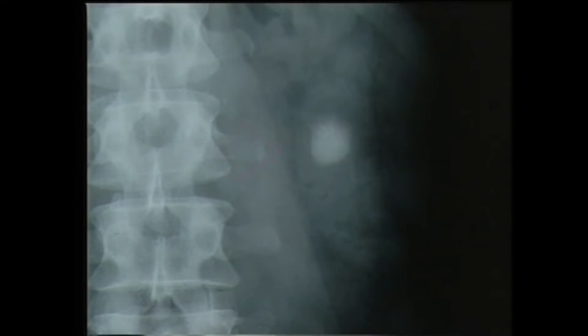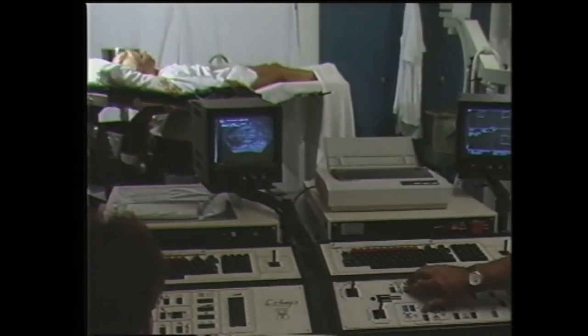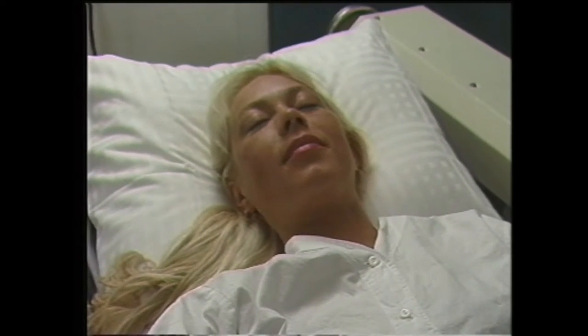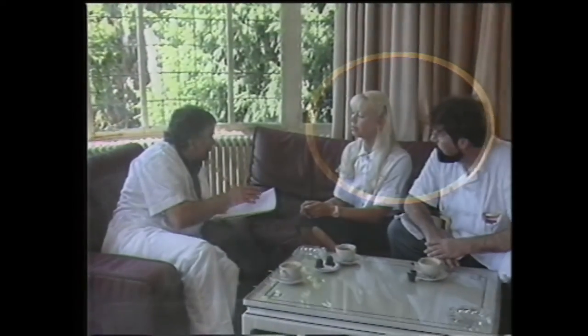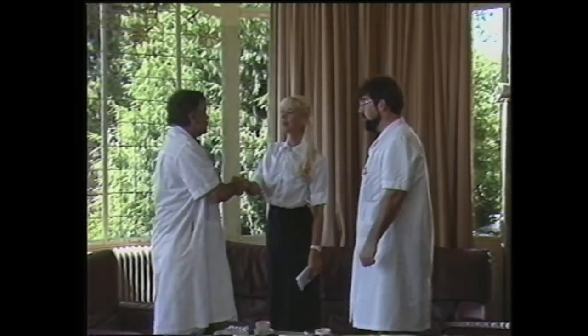Cette radiographie montre la présence d'un calcul piélique qui nécessitera un traitement d'environ 60 minutes, sans douleur apparente pour la patiente. Ce cliché péropératoire montre une dispersion du sable dans les calices. La patiente, qui pourra regagner son domicile immédiatement après le traitement, reçoit un document lui expliquant les complications possibles : hématurie, colique néphrétique ou état fébrile. Environ un mois après l'intervention, nous revoyons la patiente afin de pratiquer une radiographie de contrôle.